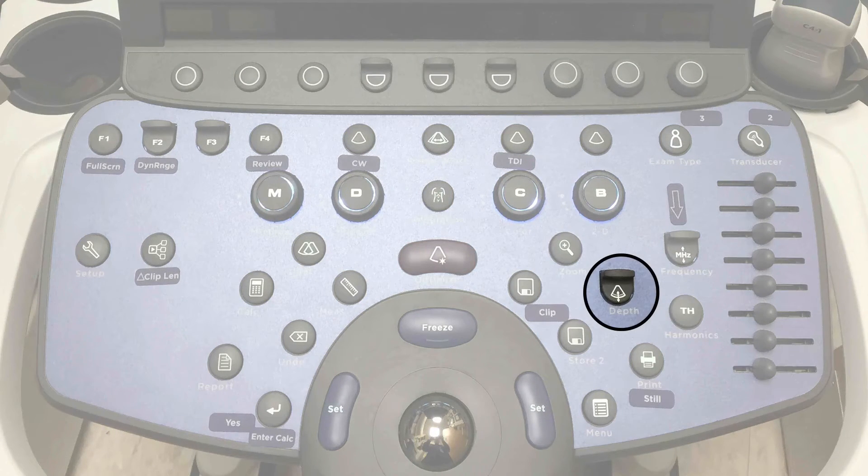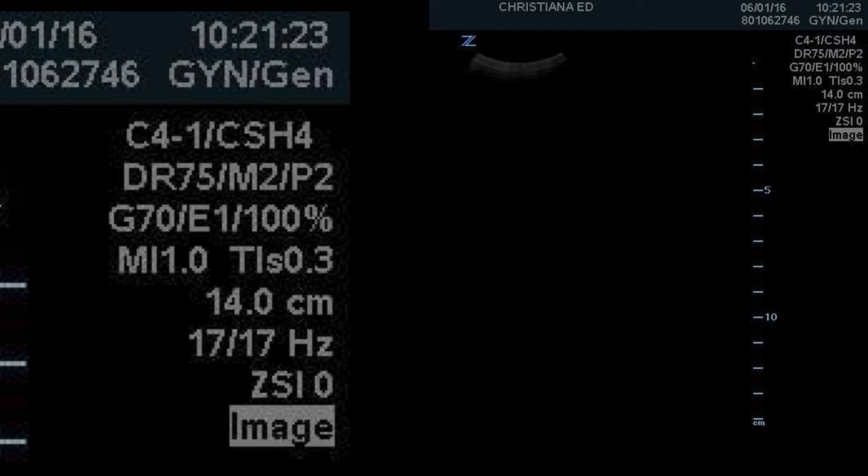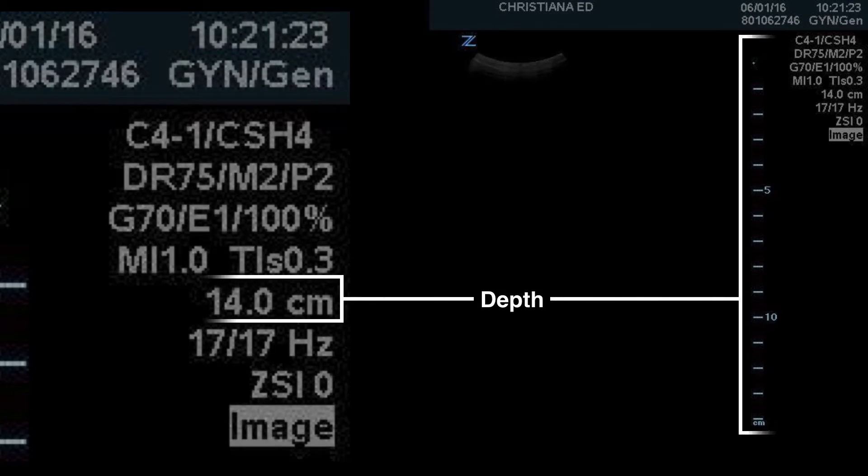To change depth, remember: as you toggle down you are imaging deeper, increasing depth. As you toggle up you are moving the display more shallow, decreasing depth. Here you can see an imaging display and a close-up of the information section showing the depth displayed and the tick marks on the right side of the screen.